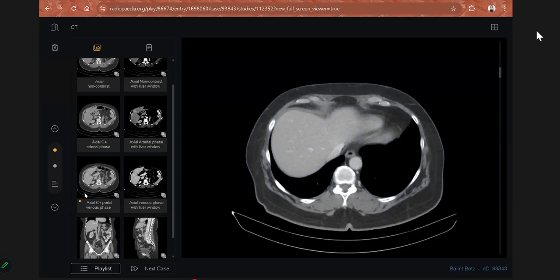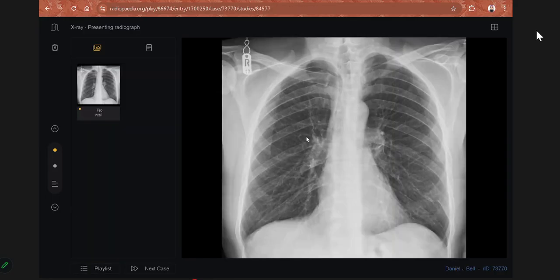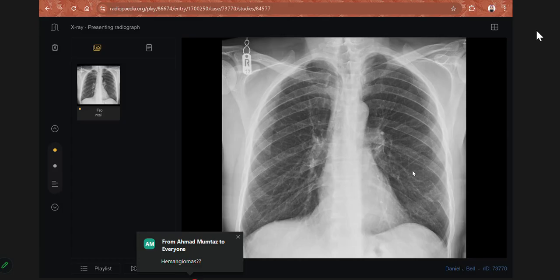Okay. So regarding your feedback, this was your first case. Here, you say this one is an expansile lesion, lytic expansile. Then you give a differential of fibrous dysplasia or mets, maybe a brown tumor. The differential is good, but in your first instance, you couldn't pick the pathology, and then the examiner gave you hints, and then you picked the pathology. Okay, good. So your differential, okay.